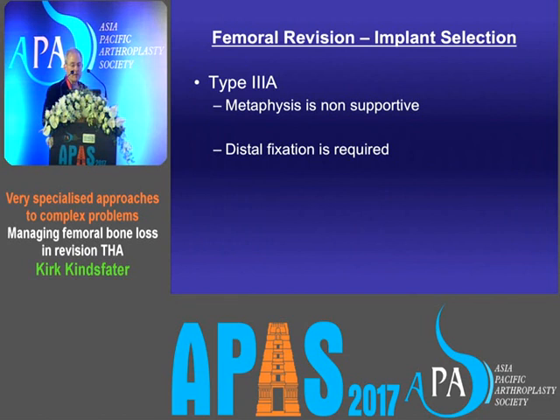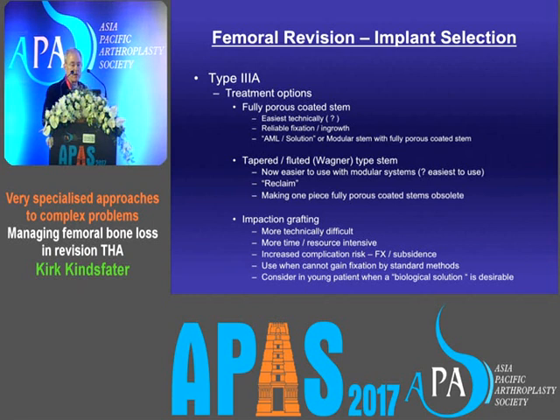The type 3s, again, the metaphysis is not really supportive. You need distal fixation. Kind of the same options. Wagner stem works very well. I think now that's the easiest stem to use.